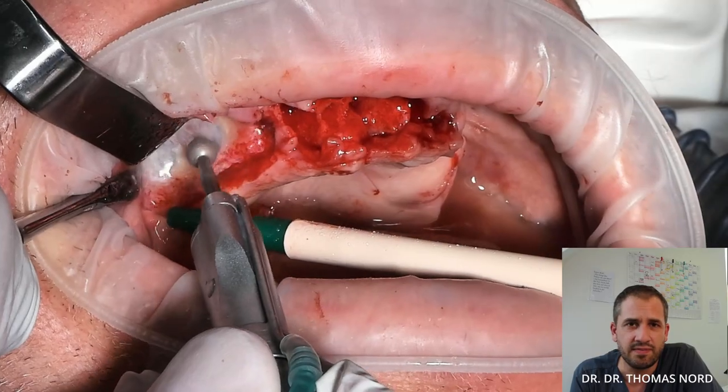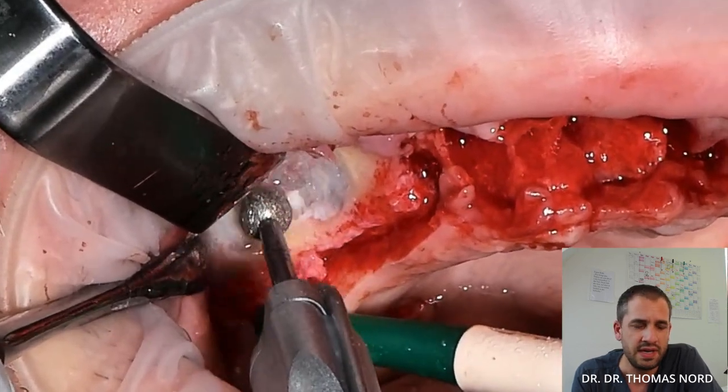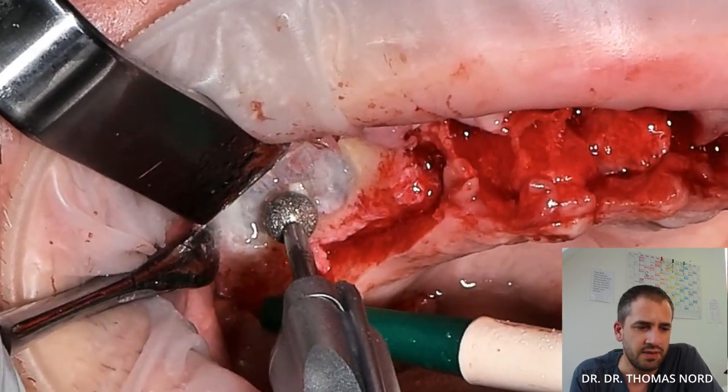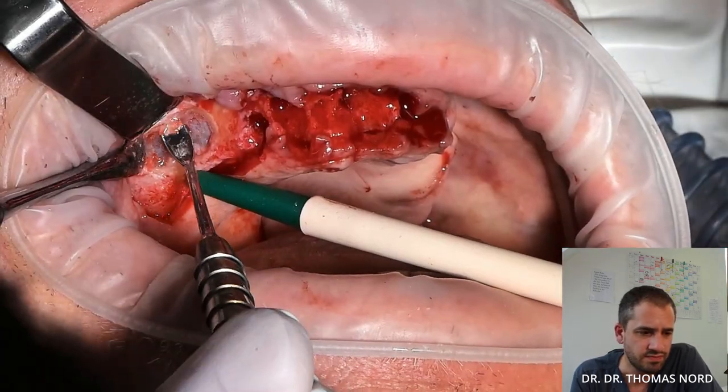First I started with an external sinus lift on the right side. You can see there's a septum in the middle, and I prepare with a big diamond drill. Now I remove some bone chips from the lateral window.